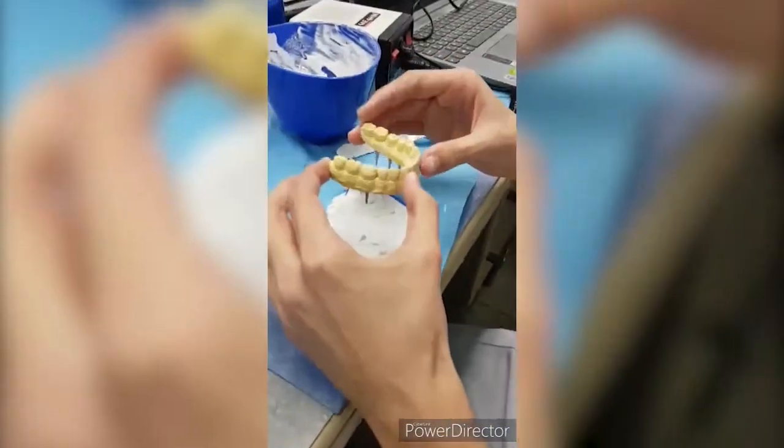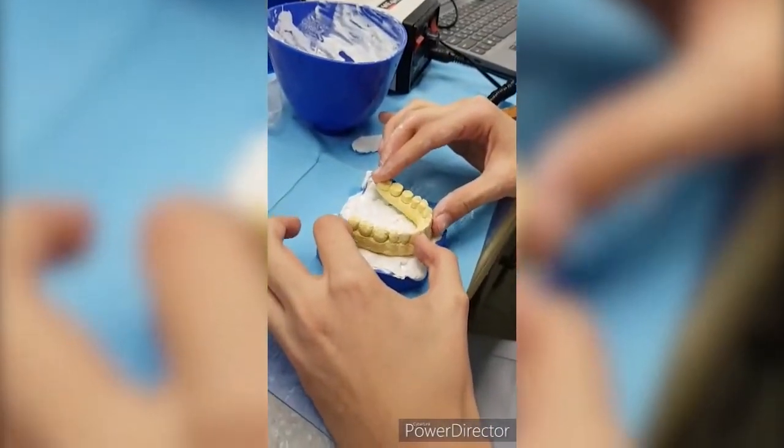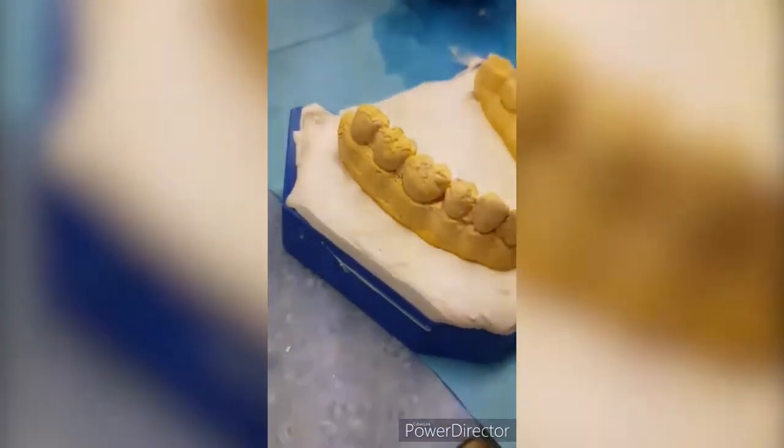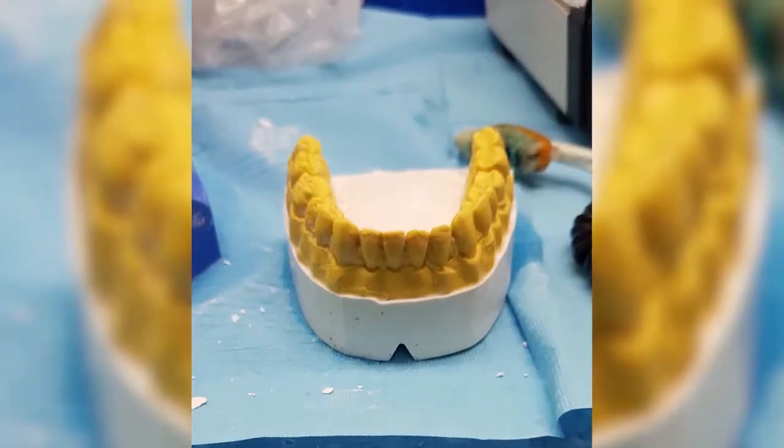Place the cast with pins on the base former containing the gypsum. Trim the final product.